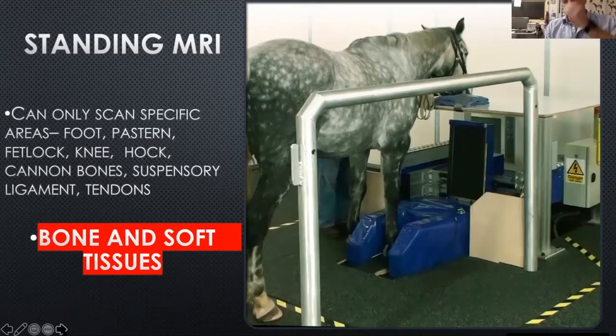When we have a horse come to Ballarat for an MRI, we advise people that the horse needs to be here for most of the day to give us plenty of opportunity, but we'll often send them home the same day. With the bone scan, they have to stay for at least two nights — they come in the night before, get the bone scan, and then have to stay until they're non-radioactive. But an MRI on a good, well-behaved horse can be in and out in four to five hours.